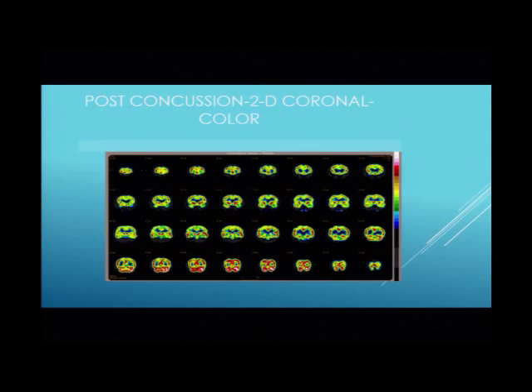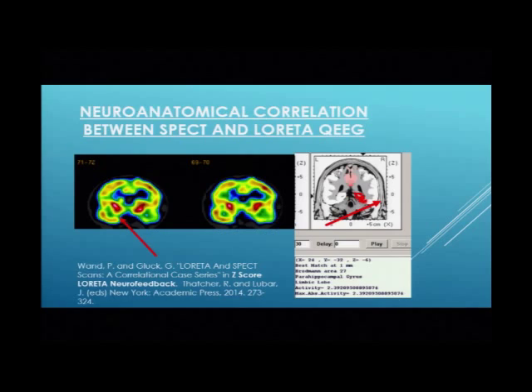And these are the coronal. Remember, I promised to show you the temporal lobes as a circle. Everybody can see that there because the right temporal lobe looks not too bad. Look at the left, though. The left temporal lobe is not good. It's very thin. It's very yellow. Over here, you can see it. I'm going to show you a blow-up of that later on. And look how subtle this is. Can you barely see that it's missing something on the bottom there, on the left side? That's the left frontal lobe, and that's the left temporal lobe, so that starts to get that asymmetry that I told you about before.